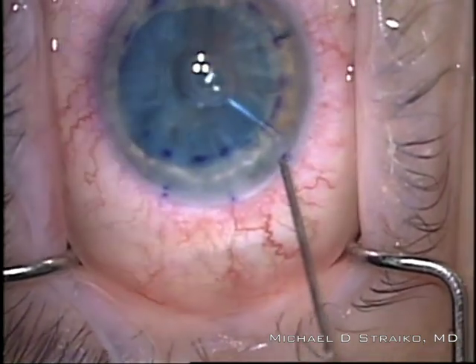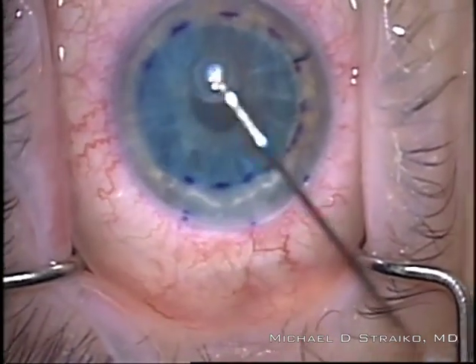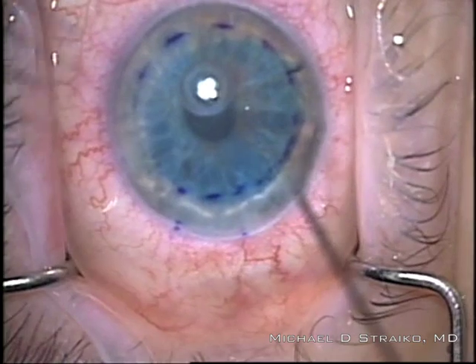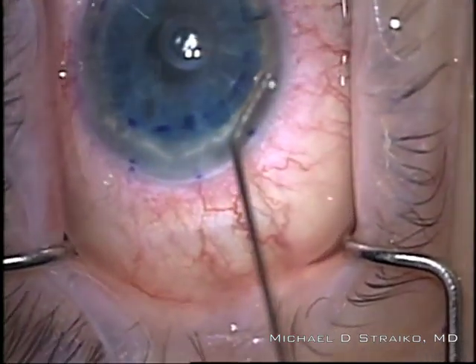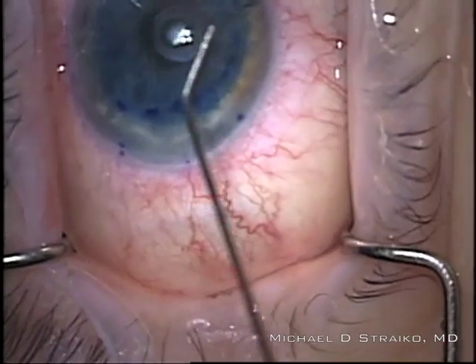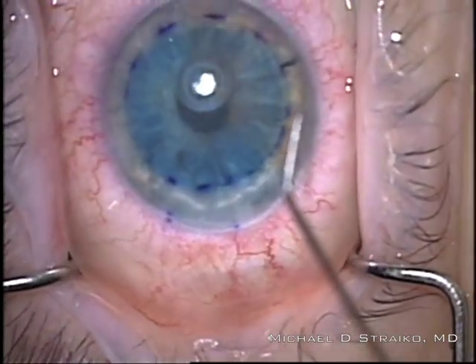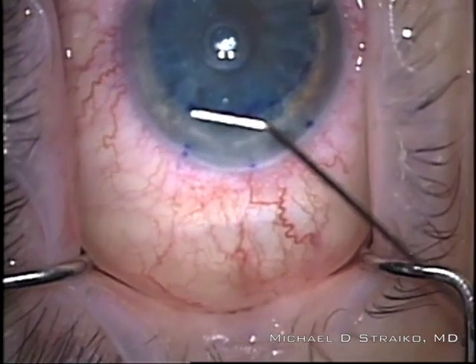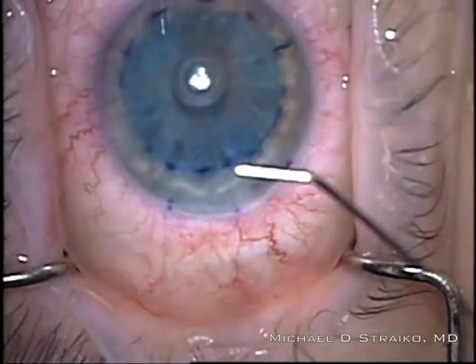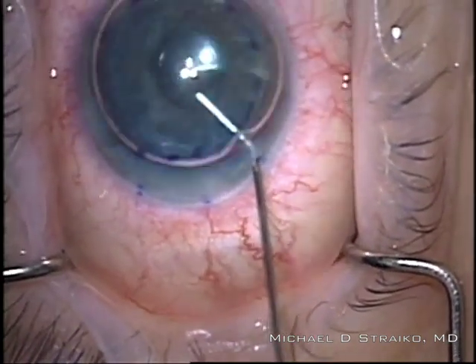I'm going to put in a very small bubble. I use a TB syringe set to 0.2 ml and inject a 0.2 ml bubble — that's much easier than trying to inject a similarly sized bubble with a larger syringe. Now I'm moving the eye in the direction I want the graft to move, then applying taps and sweeps to move it across the cornea. Once the small bubble is in the eye, the DMEK graft behaves more predictably — more like a DSAEK graft — because there's a little friction now between the graft and the patient's cornea. We're also assured the endothelium is protected because the graft has already floated up.